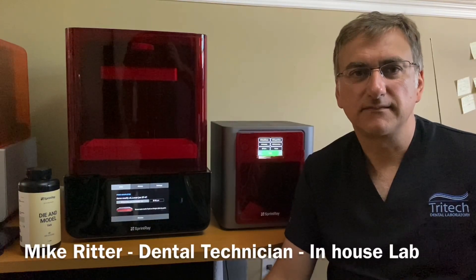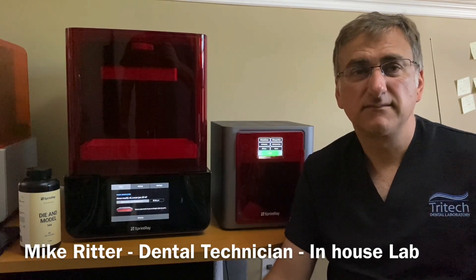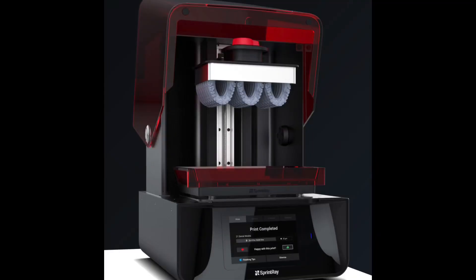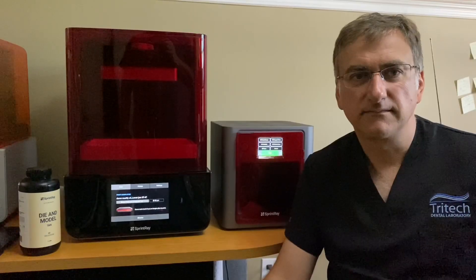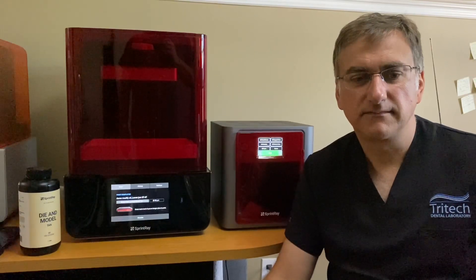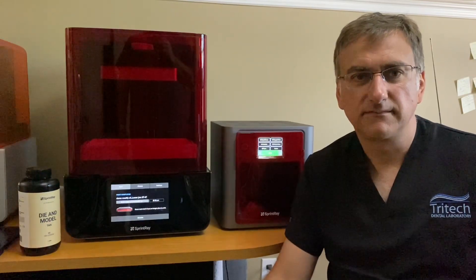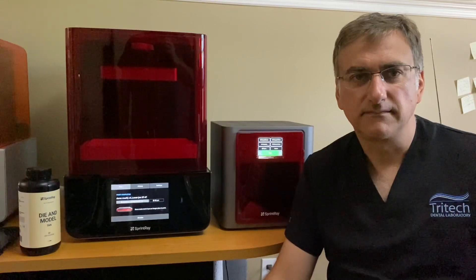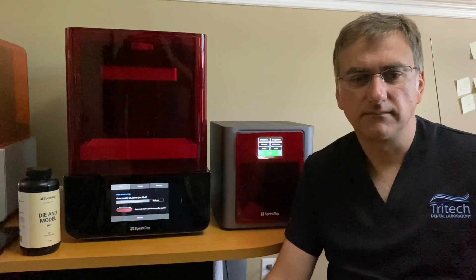We are at the lab here with Mike Ritter, dental technician, and we're going to talk a little bit about the Sprintray printer. We just got this in and we're quite excited about it. We've been using it for about a month now, having used other printers for a number of years - but this is our second printer. We went to a DLP printer rather than an SLA printer for the quality and also the speed. Mike's going to tell us a little bit about this.